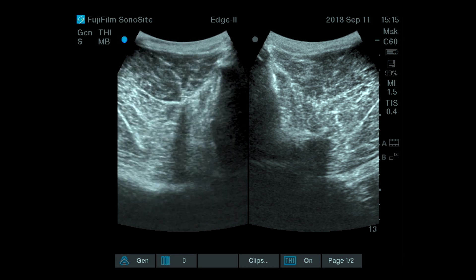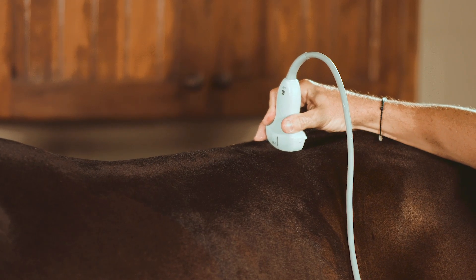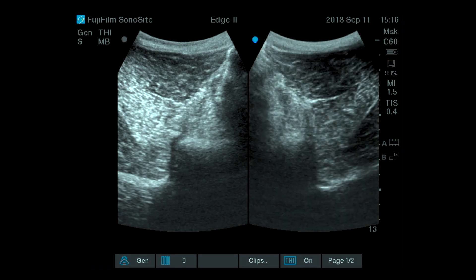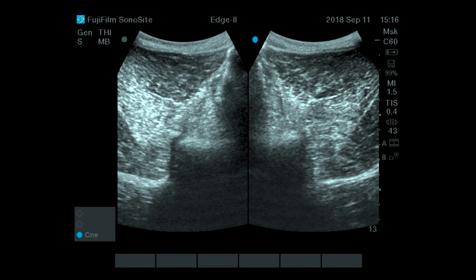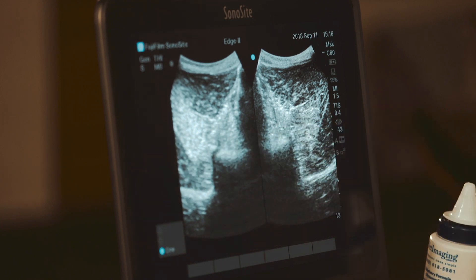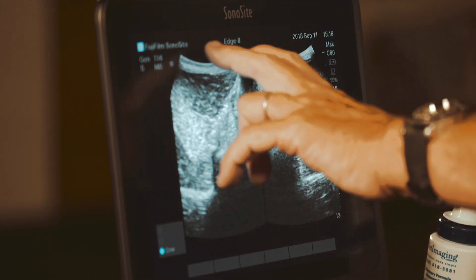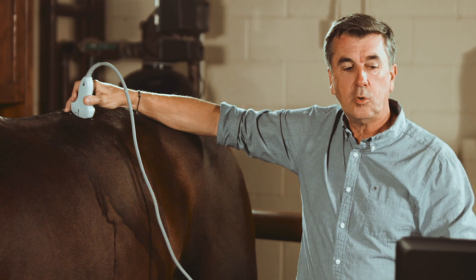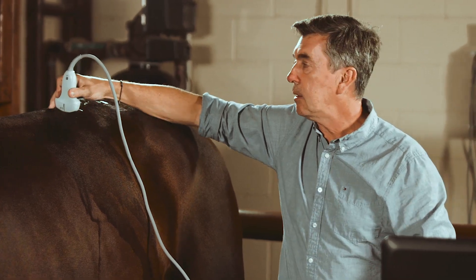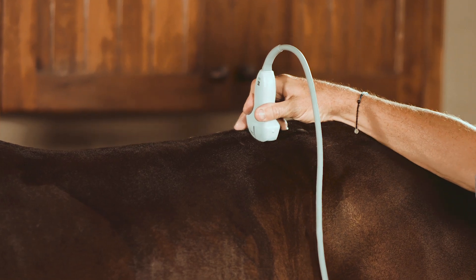Going a bit more caudally to evaluate around the level of L2-L3, I update the screen to see the right side — a nice picture of the junction at L2-L3. This is the left, this is the right, this is the multifidus muscle, this is the spinous process axis, and the longissimus muscle on the left side more superficially with the fascia. As you go more caudally, you evaluate every vertebra one by one, with the cranial and caudal aspect of each facet.